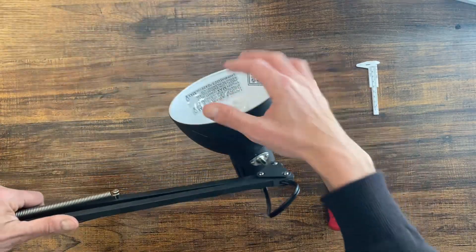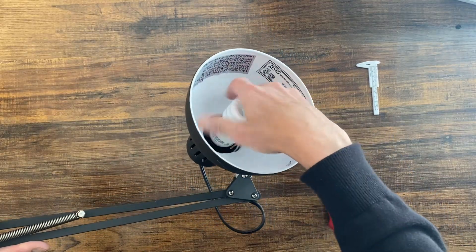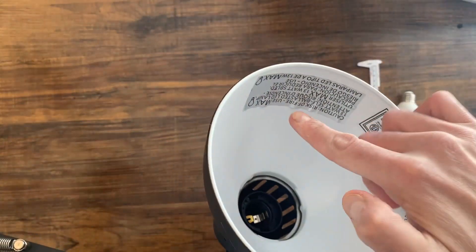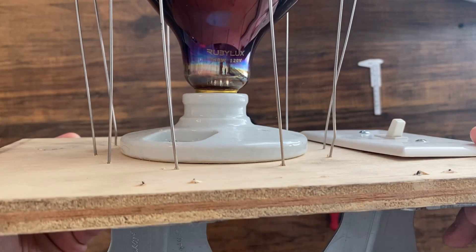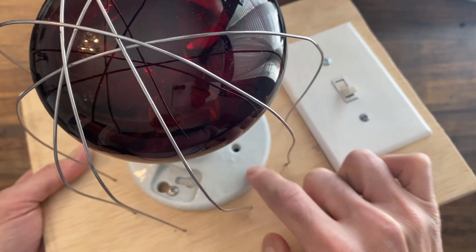A lot of people ask me why don't you just get the light bulb and replace it in any of these sockets. The problem is most of these newer design sockets are plastic and they're rated for low wattage. The red light lamp is rated for 250 watts, and that will require the socket to be able to handle all this heat.